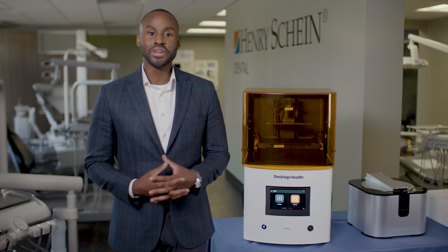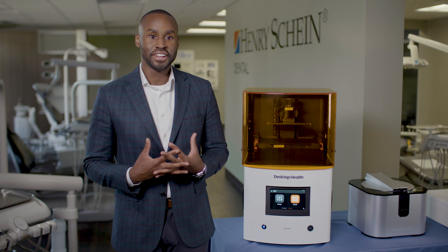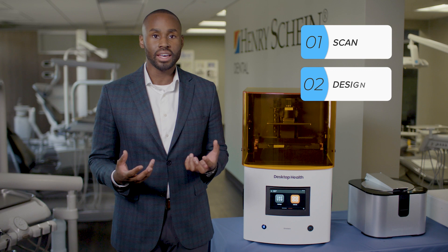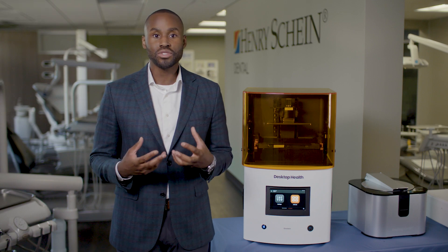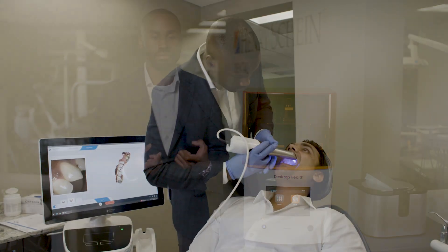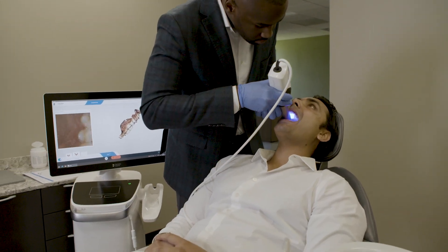When looking at 3D printing for surgical guides, there are five essential steps you need to consider. Much like with any other 3D printing workflows, we'll go through the scan, design, 3D print, wash, dry, and then the final curing stage. The main difference with surgical guides is that you're going to need an extra digital input in the form of a DICOM file to plan your implant case digitally.